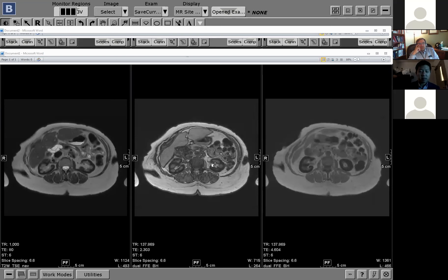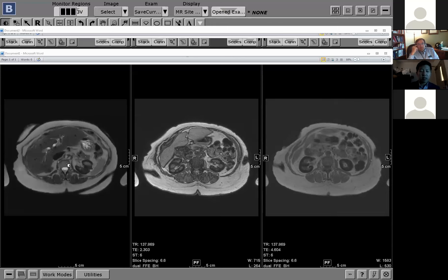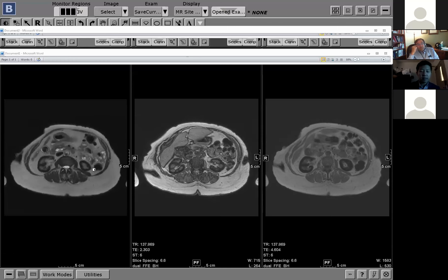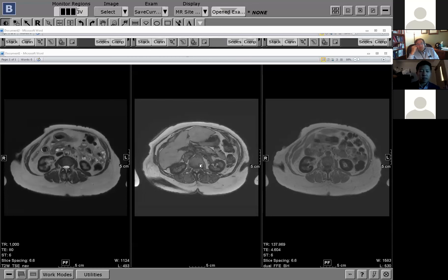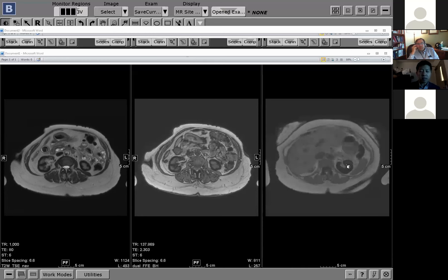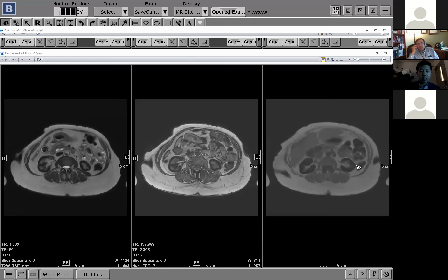You can see there's a T2-weighted sequence here. This is the out-of-phase and this is the in-phase. Typically the TE on the out-of-phase is shorter than the TE on the in-phase. The cortices in the kidneys are very, very low signal on T2, and as you prolong the echo, they become even darker.